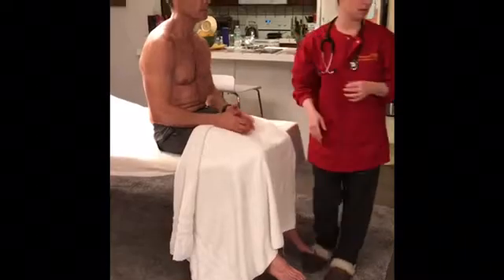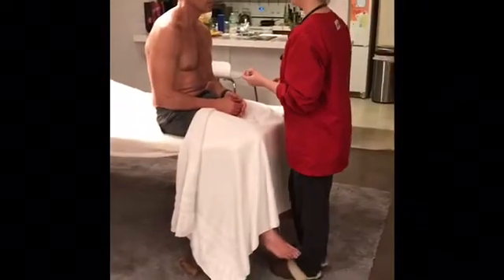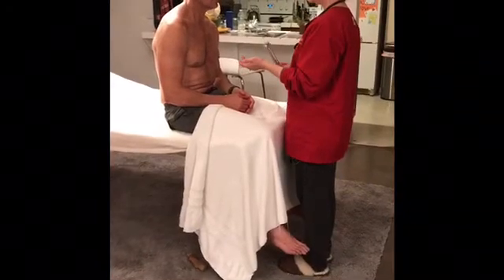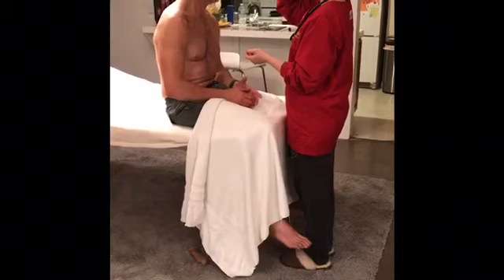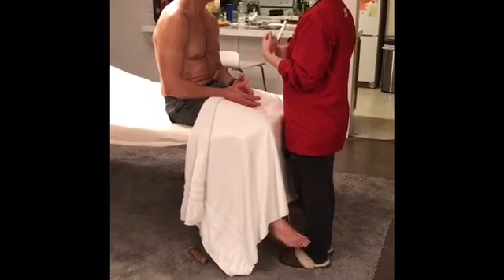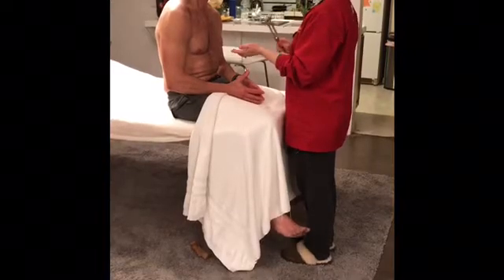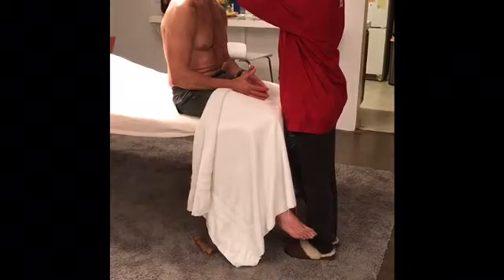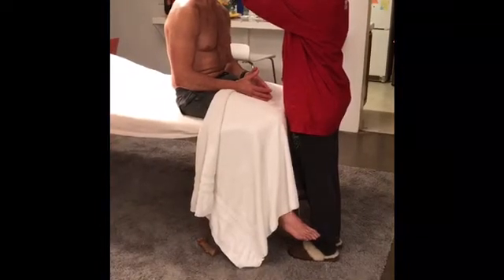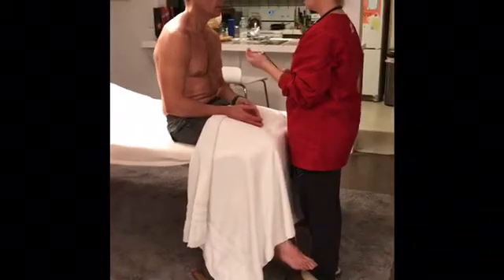Perfect. And now we're going to go ahead and do the Weber and Rinne tests. First, we'll go ahead and do the Weber test. I'm going to go ahead and knock this on my wrist, and I'm going to put it on the middle of your temple, at the top of your head. And you let me know which ear you can hear the best, or if you can hear it the same on both sides. Same on both sides.